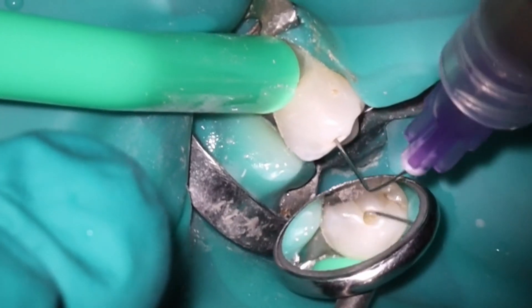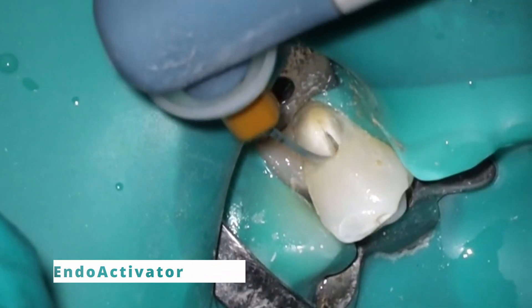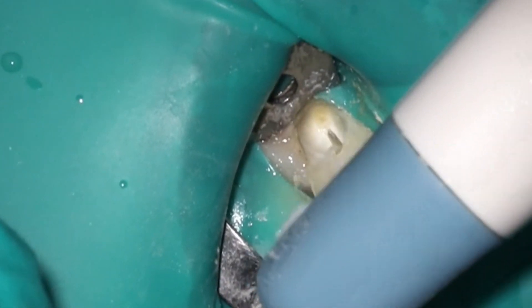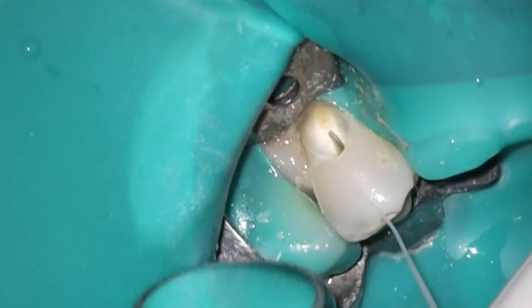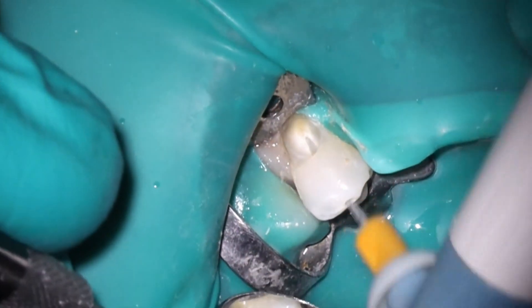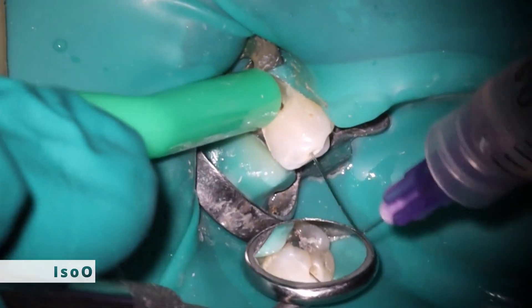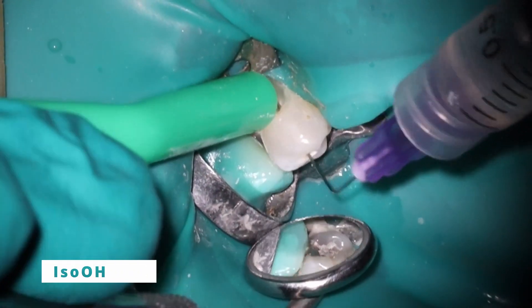One of the ways we prevent snap-off failure is by putting a post inside here and having the axis run right through the long axis of the tooth — that post will help resist that snap-off failure. That's why I do posts on so many teeth: it's not to retain the core, it's to help protect from snap-off failure. Also, the endoactivator had a little bit of a bend in the tip and wasn't getting inside there, so you flip it 180 degrees, flip that bend back, and it drops in very nicely. If you're ever in the same situation, bend it back towards the lingual, or palatal if it's on the maxilla.